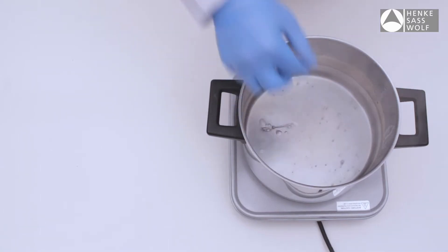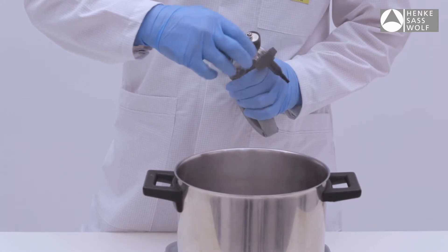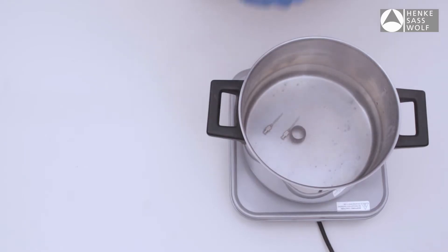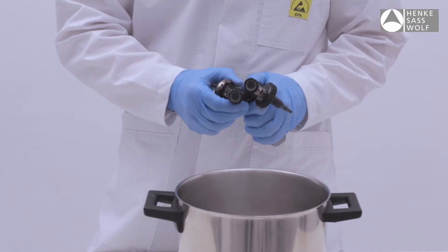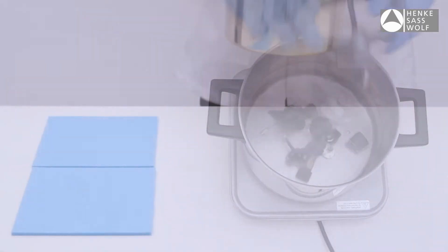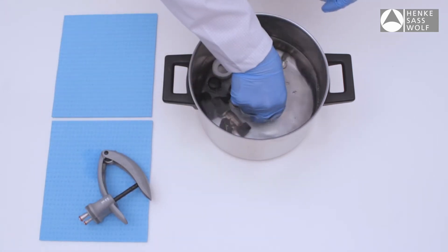Suspend the complete Eco-Matic Twin including needles or nozzles in a container of water and boil for up to 20 minutes. Ideally the cylinder will be disassembled from the handle and the syringe boiled in a disassembled condition. Remove the Eco-Matic Twin from the container and let it dry.